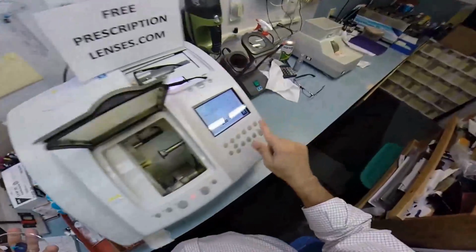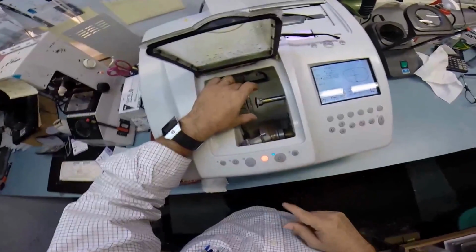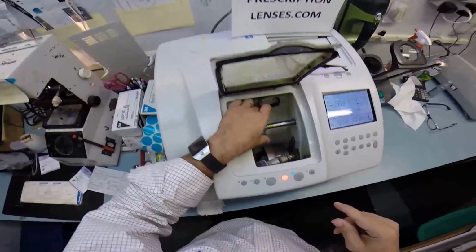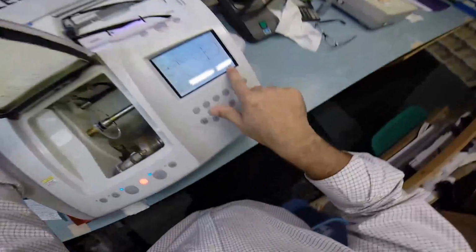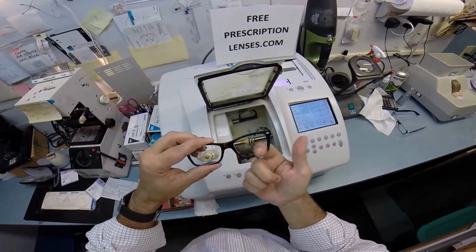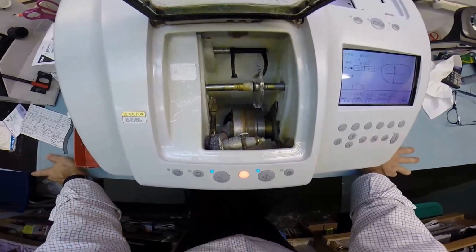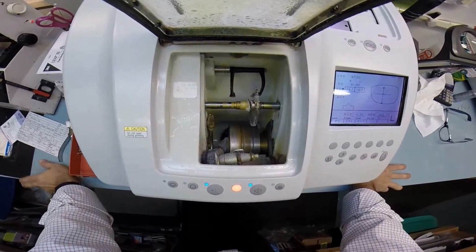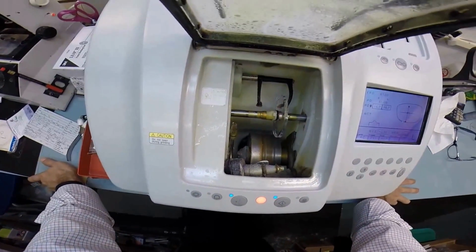So I'm going to flip this over to L, which stands for, it's Latin for not right. I think it's Latin. Something about me is not right. I'm going to tell you that now. Maybe it's something I ate. But I flipped it over to L, and we're going to cut the left lens, and this time it's going to trace the shape of the left side of the frame to make sure the lens is large enough to fit in there, always starting with the concave surface, the rear surface, and then it's going to move over and trace the convex front surface.